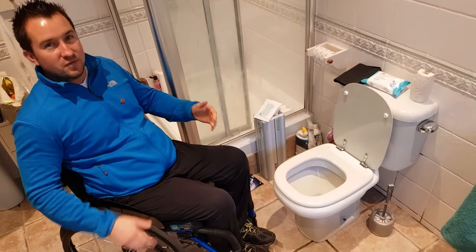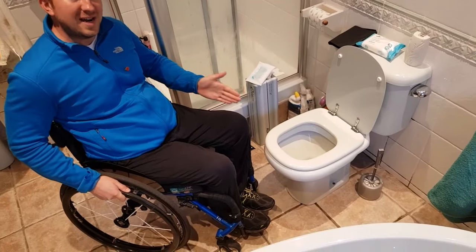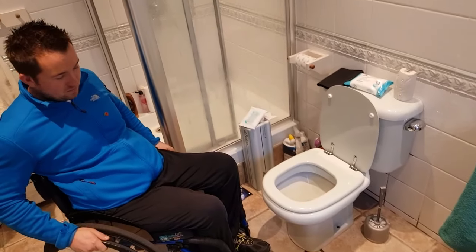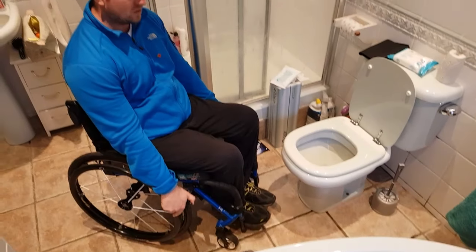I'm going to show you how I transfer on and off the toilet for the morning routine. First thing I do is come up to the toilet at this angle — it's about as good an angle as I can get. I flick the casters forward so I've got the maximum stability I can on the chair. By doing that I just push forward, roll back, and the casters are then pointed forward so there's no chance of rocking the chair over.